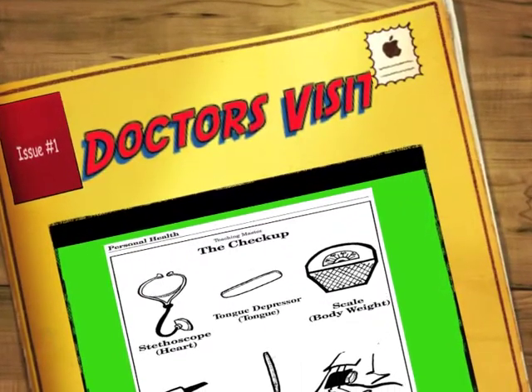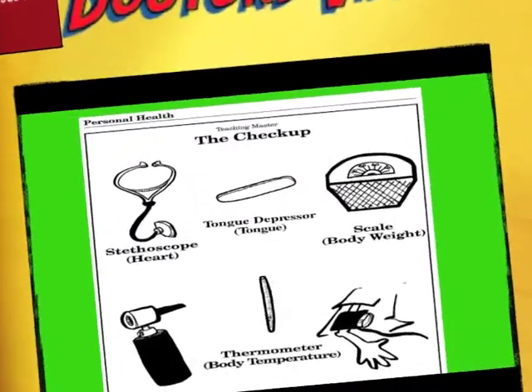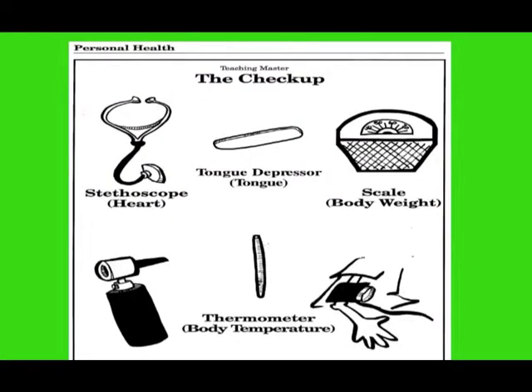Okay, boys and girls, right now I'm going to explain to you all the different instruments or different tools that the doctor uses at your normal doctor visit or at your normal checkup. First thing we're going to go over is things like stethoscopes, tongue depressors, scales here to check your body weight. We're going to check the ear or the otoscope. We're going to check the thermometer right here. And then also this thing right here, this is a blood pressure cuff. So we're going to explain all those different things in a minute here.